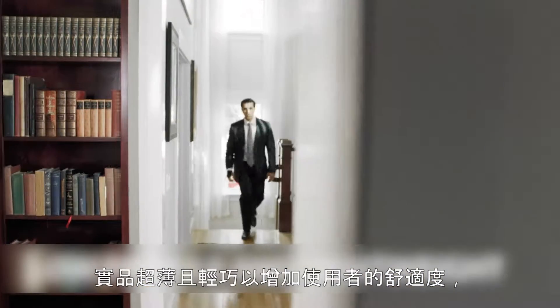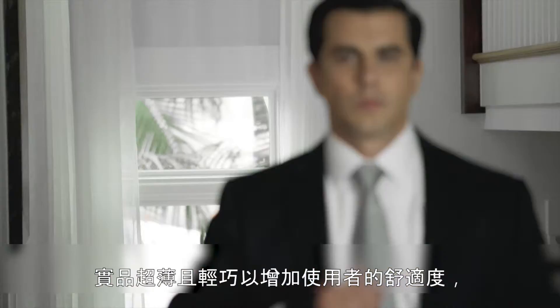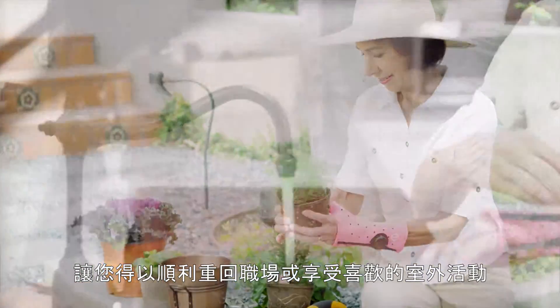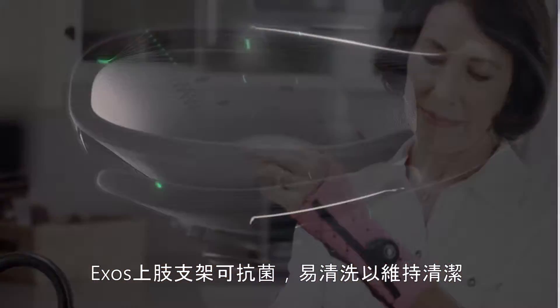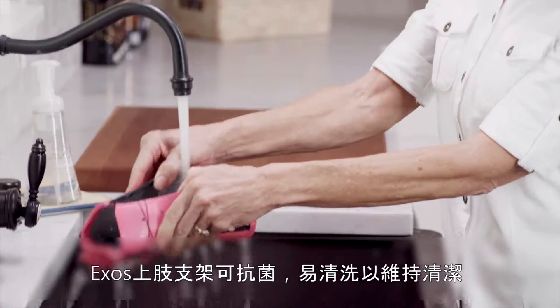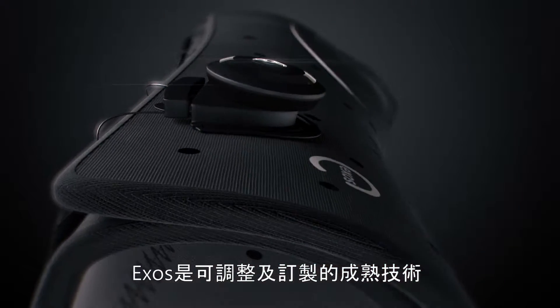Its low profile and lightweight design increases patient comfort and lets you seize the day — whether it's back to the office or doing your favorite outdoor hobby. Exos upper extremity braces are antimicrobial and can be easily cleaned to maintain hygiene.